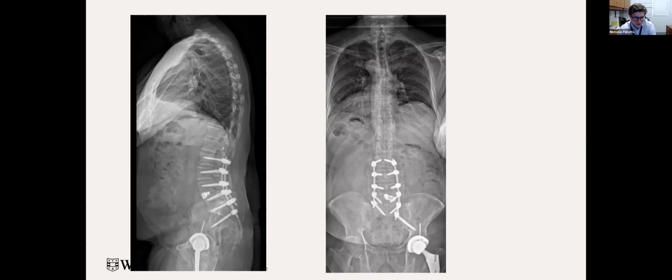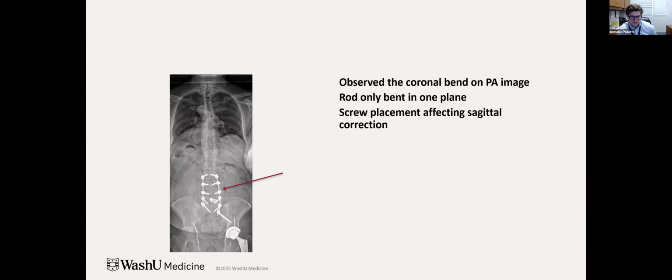And I do think this is a little bit short of the plan for a couple of reasons, and I'll show you that. Although this patient, I will say, was extremely happy, had basically no pain within a few weeks of the operation, surprisingly, and actually had a fair amount of neurological recovery. And he's now almost a couple of years out, and is doing quite well.